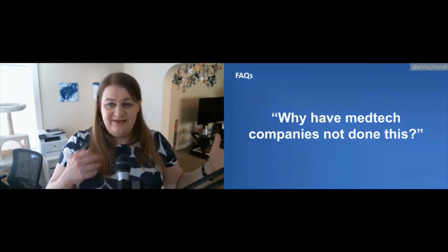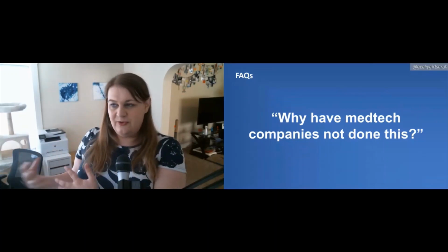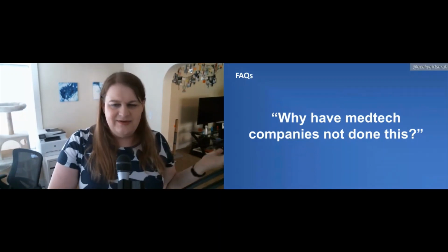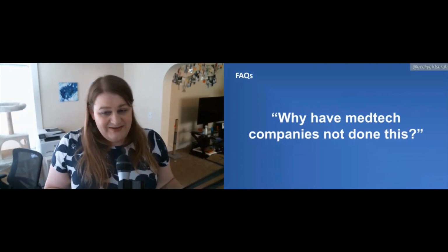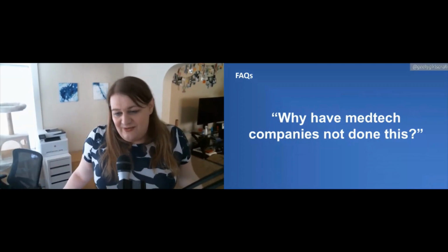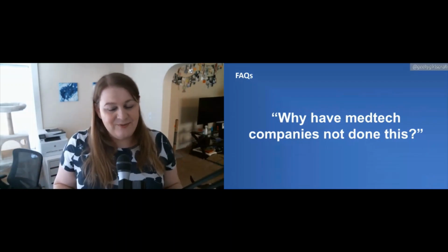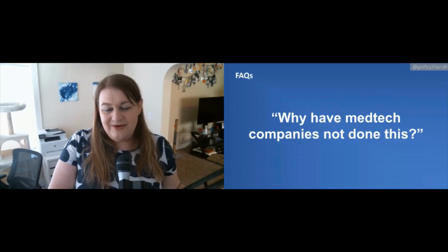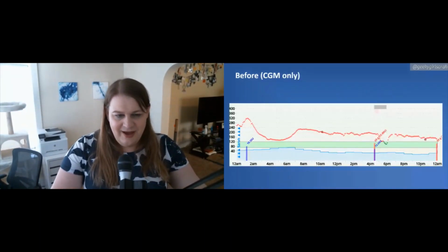They're trying to be this sort of nonprofit bridge between the open source stuff and the closed source pumps and things. So they're still kind of working on this stuff. We'll see how that evolves over time. Okay. So with just my CGM, I had terrible management. You can see all these red numbers. I was very often in the upper 100s, 200s. I wasn't super great at managing this, even with my science, math, technology background.